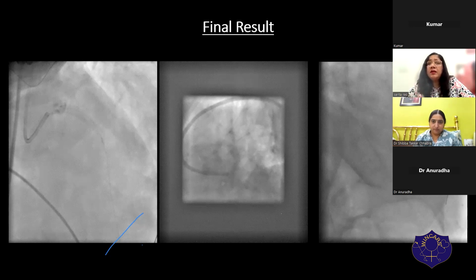Thirdly, regarding vessel preparation, I had used orbital atherectomy and gone to both the speeds, 80 and 120, and spent a good amount of time prepping the vessel. Then I followed it up with an NC balloon and a cutting balloon. When your cutting balloon is opening up beautifully, you are very clear that you have created the fractures, because you've looked in two orthogonal views, you've seen the expansion, you know that there are micro fractures, and this is going to open up with just a little dilatation.